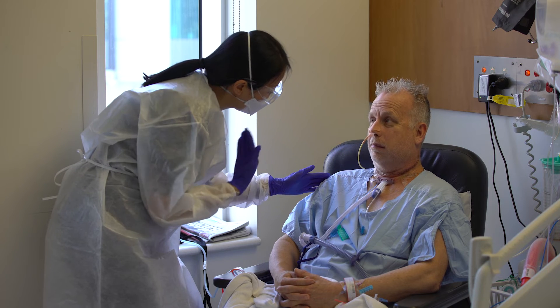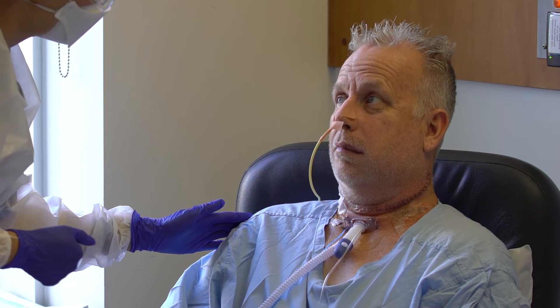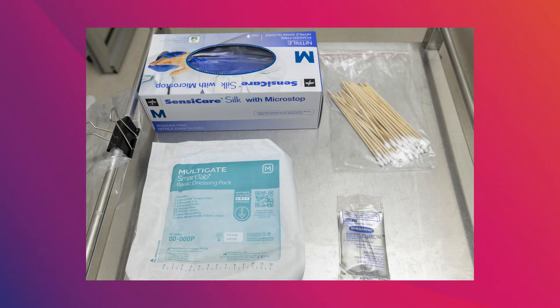Explain the procedure to the patient. Ensure that the patient is in a comfortable position. Prepare all necessary equipment.